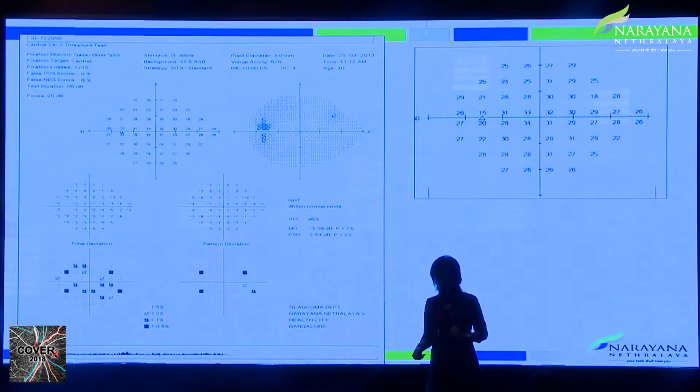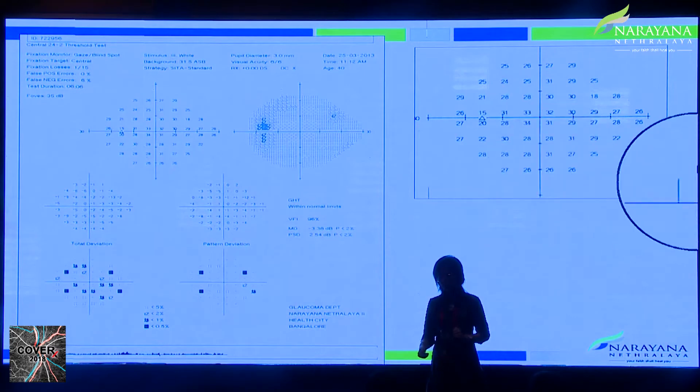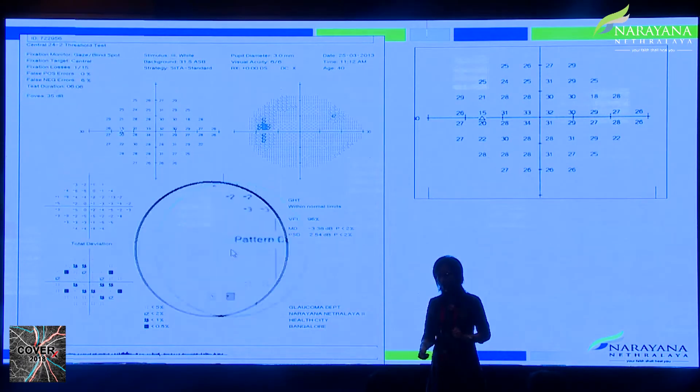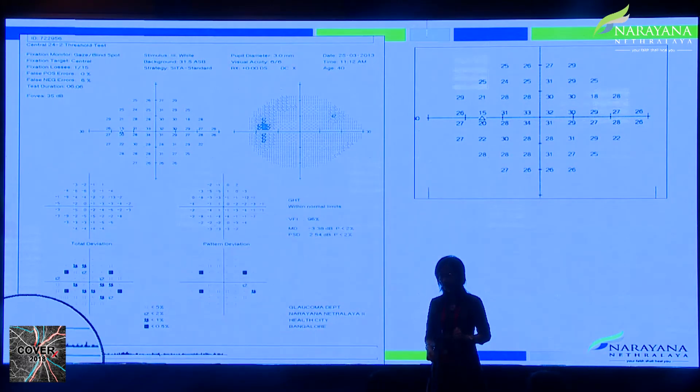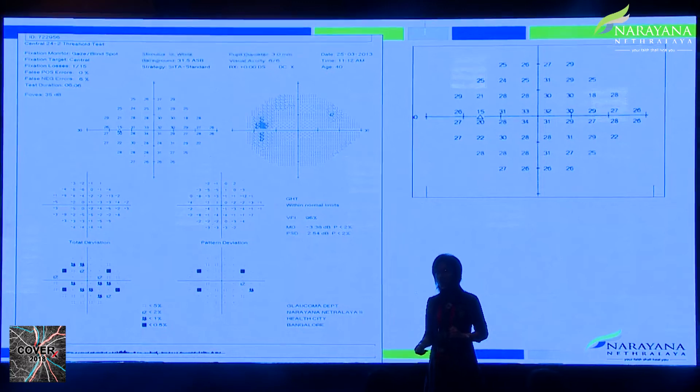A classical cloverleaf defect occurs when the patient responds well in the initial phase but then gets bored or tired — initial stimuli are responded to correctly, but later the patient stops responding. In another example, even with an acceptable gaze track and acceptable false negative/positive rates, if there is no blind spot mapped, the machine has not been able to locate the normal blind spot, which also indicates an unreliable field.